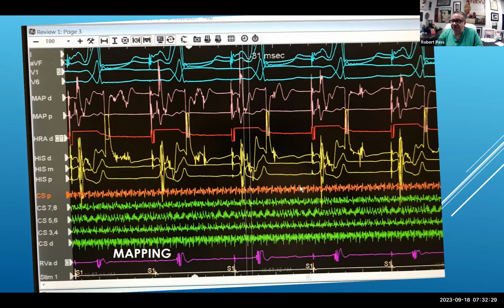So at this point, even though this is a very early signal, we don't know if we would get heart block were we to turn radiofrequency or cryo-energy on at this point. And I should tell you that most electrophysiologists in this area would use cryo. But my preference is that if I feel it's safe, I'd rather use RF because it's more efficacious, as long as we believe it to be a safe area.